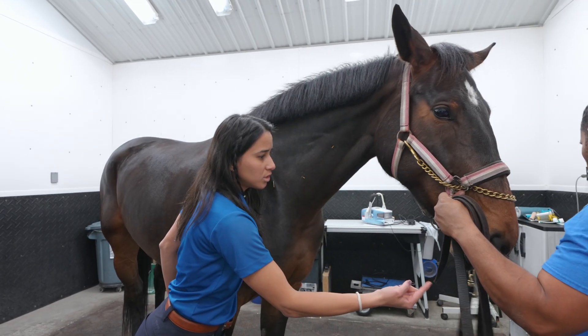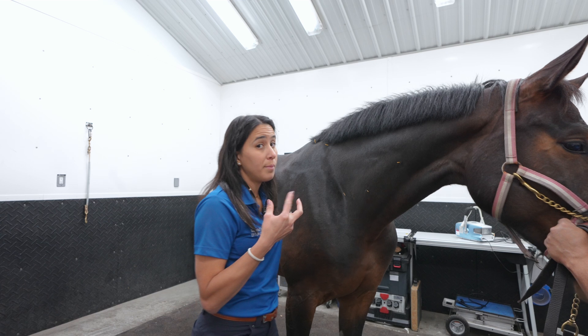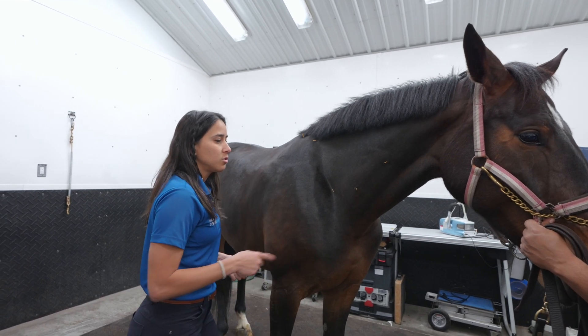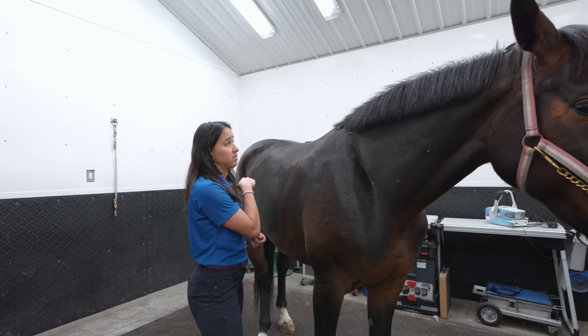You can see she is moving her lips. That means she is calming down and she is feeling it. That's a good indicator that the acupuncture is working.